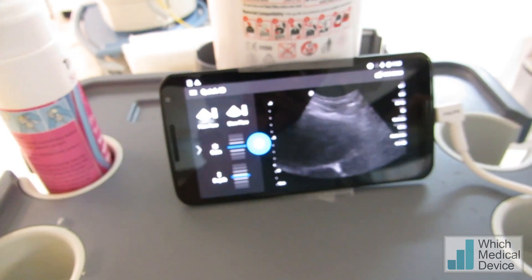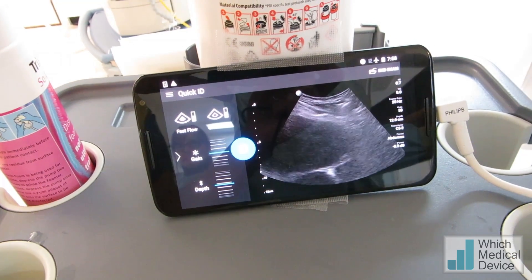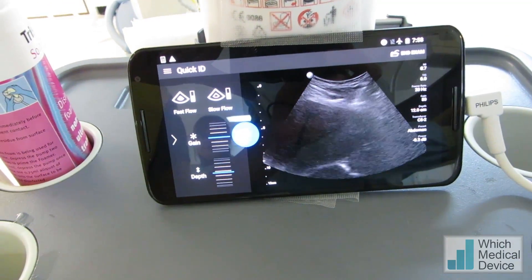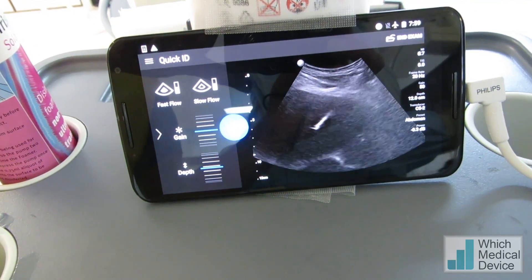You can see the size of the phone here, and we're just going to introduce our needle into the dilated system. You can see the needle coming in there, a bit of pushing now, and that's the needle in the system there. Very easy to see.